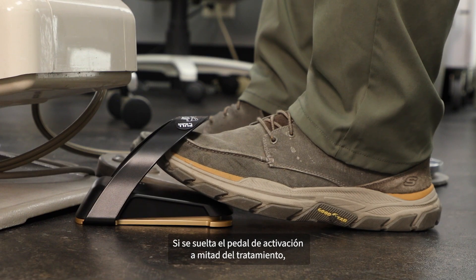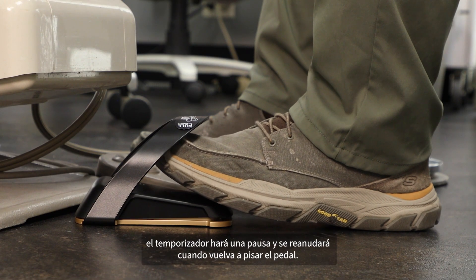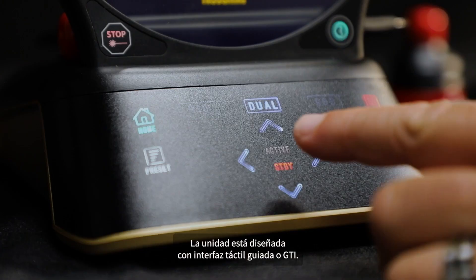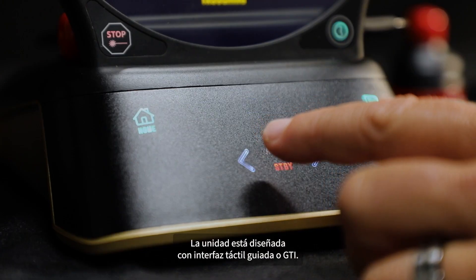If the activation pedal is released mid-treatment, the timer will pause and will resume when the pedal is depressed again. The unit is designed with guided touch interface, or GTI.